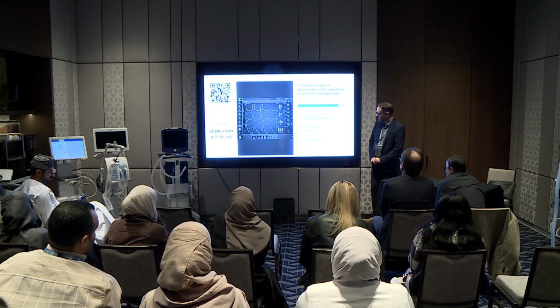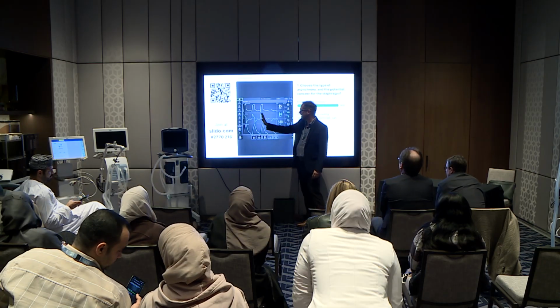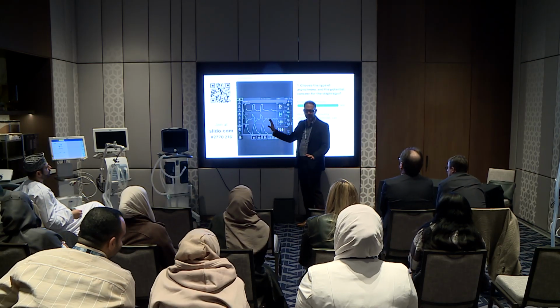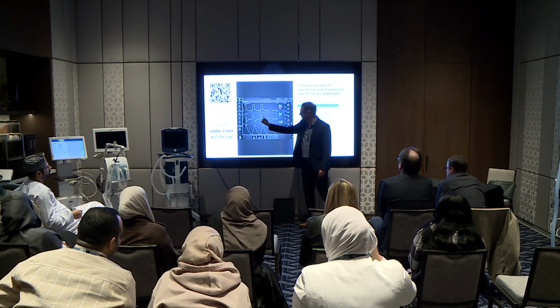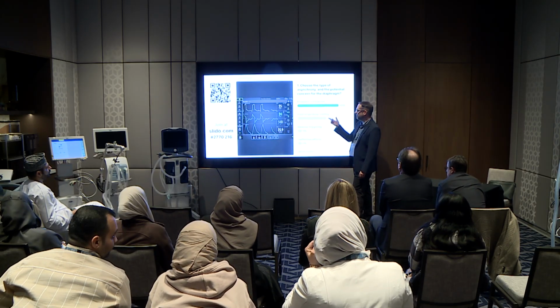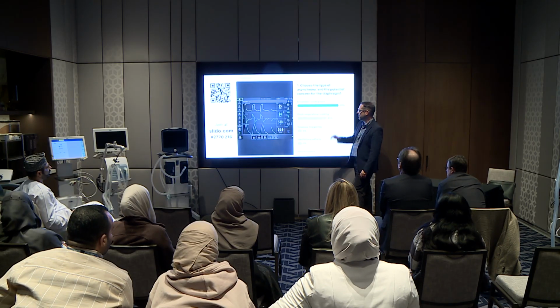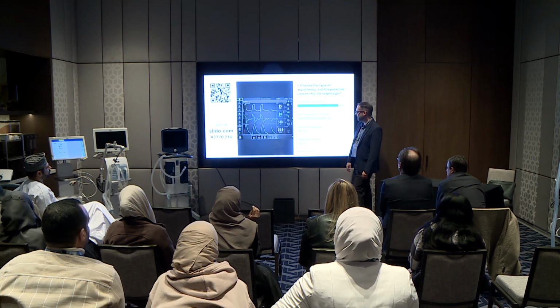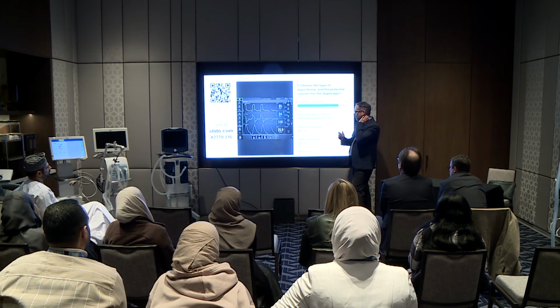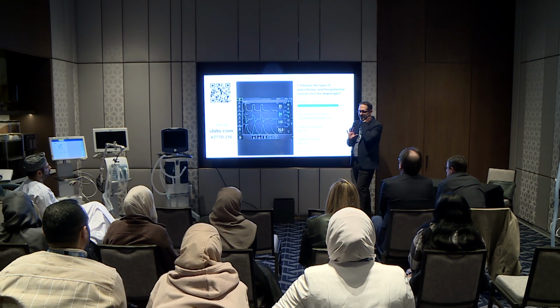Eccentric contraction is correct. Again, because the contraction is happening completely away from the inspiratory pressure, this is a full eccentric contraction. If this was early cycling, then it would be post-inspiratory loading, but because it's its own separate breath, we consider it eccentric contraction. Now, nobody chose the type of asynchrony, because I think you could make multiple choices. Does anyone want to yell out what type of asynchrony this is?